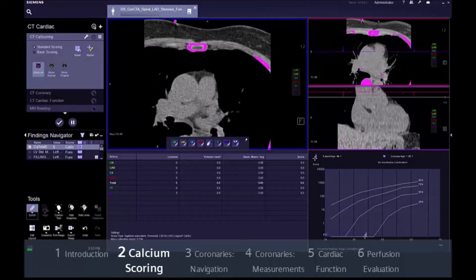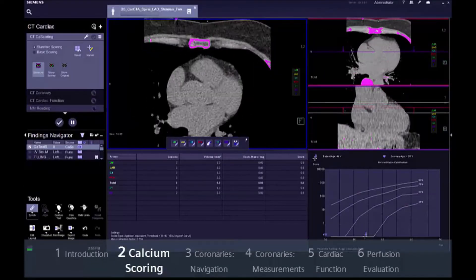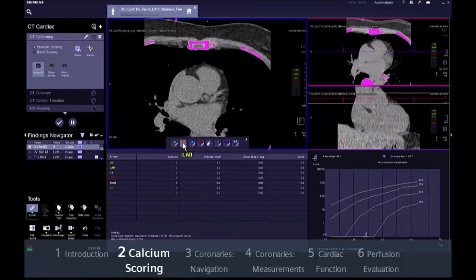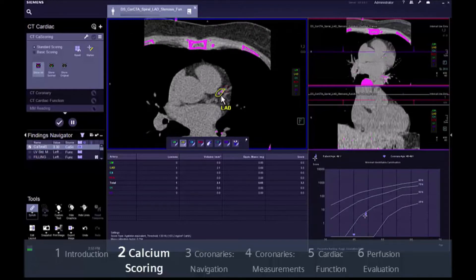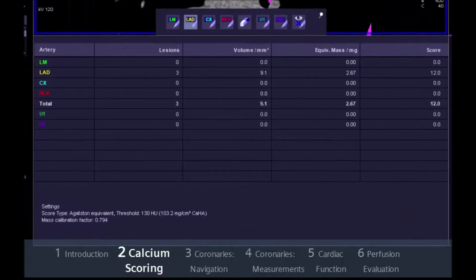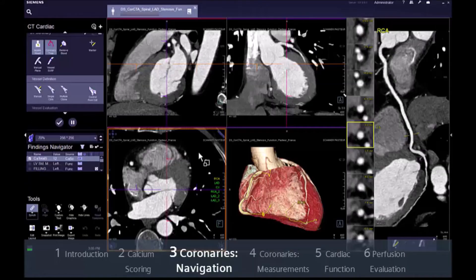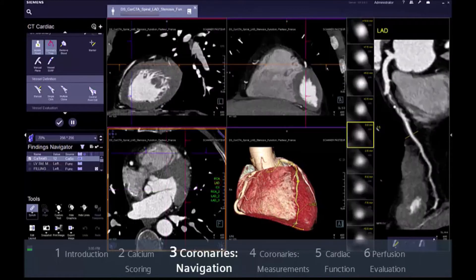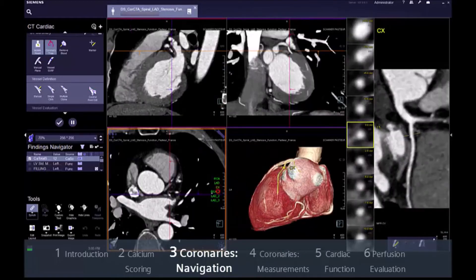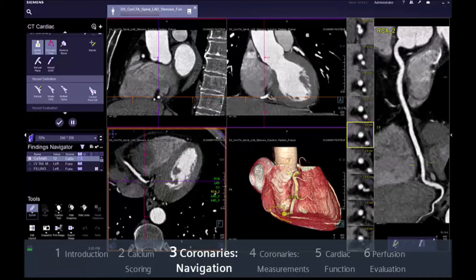In order to facilitate the event, CT calcium scoring allows accurate visualisation and quick quantification. Scoring is easily performed for the main coronary arteries. The table is automatically updated and provides a comprehensive analysis of the number of lesions, the calcium volume, calcium mass, and Agatston equivalent score. A series with the best diastole, isolating the heart, segmenting and labelling the main coronary arteries and its major branches as well as saphenous vein grafts.